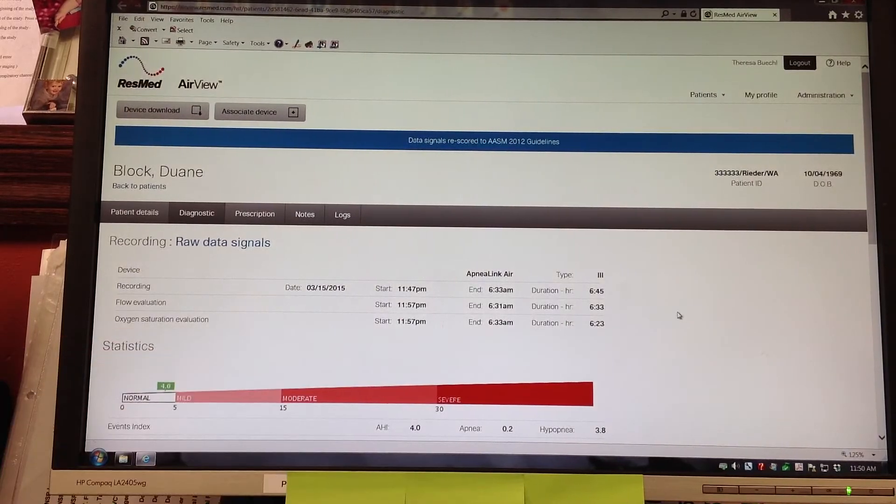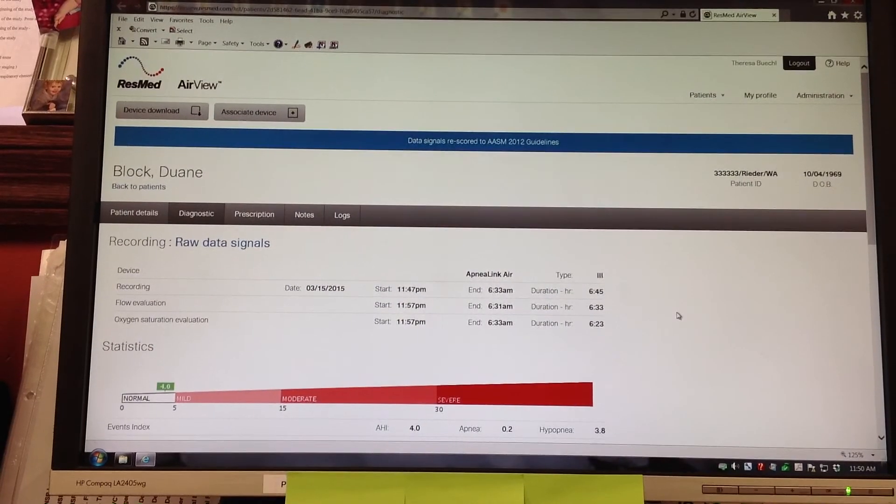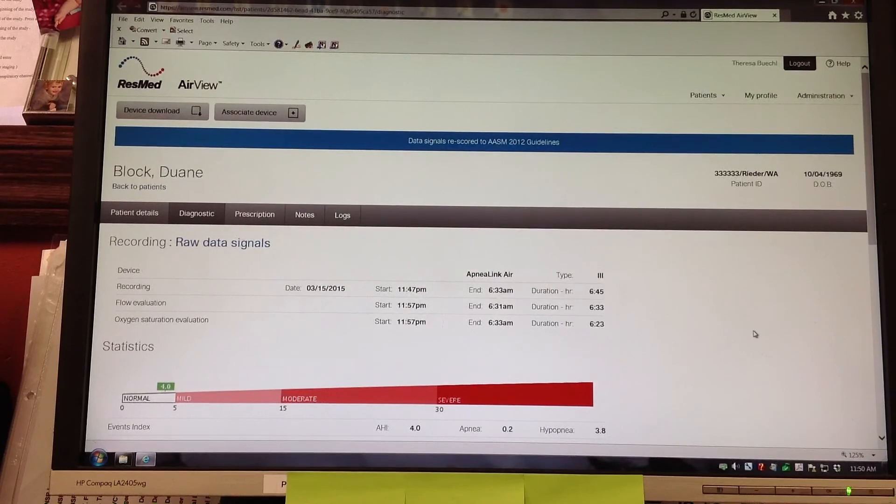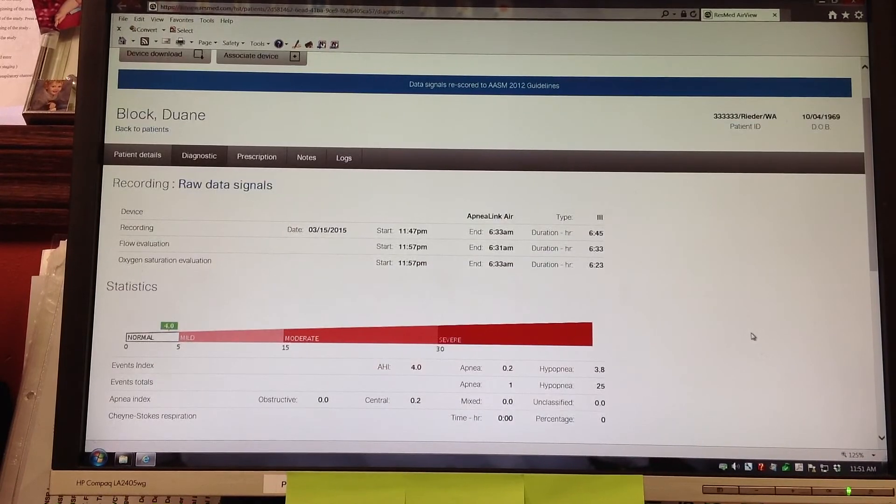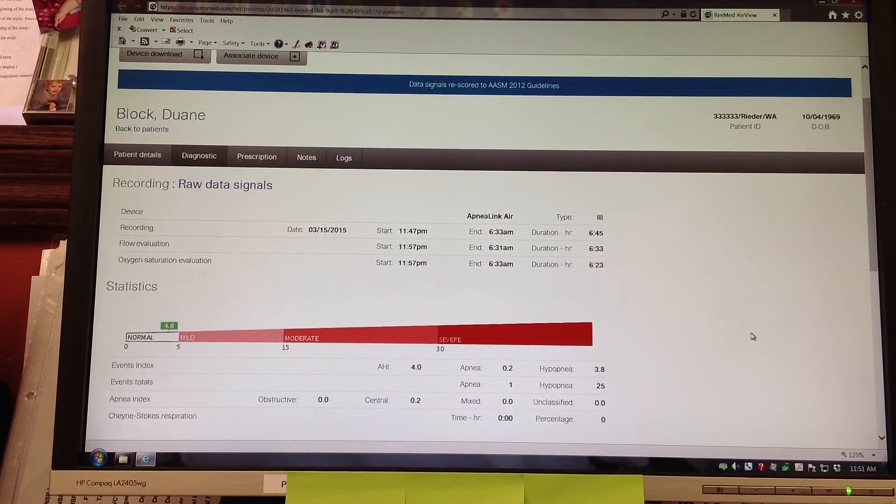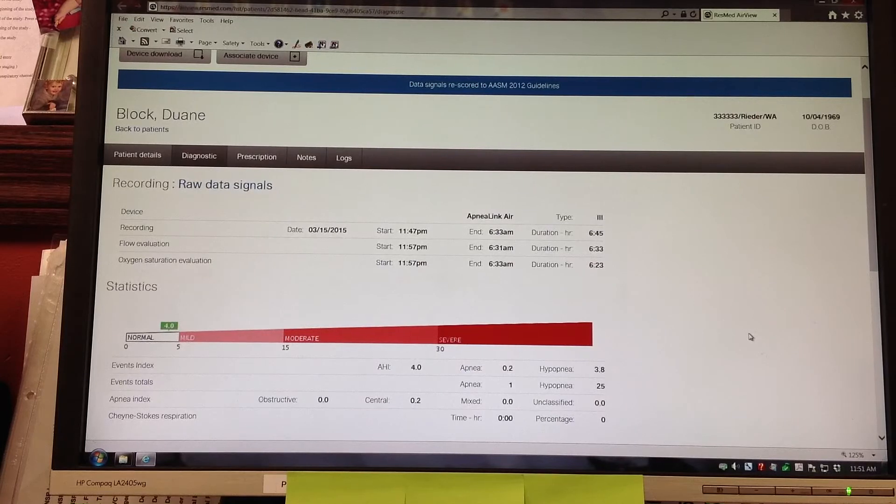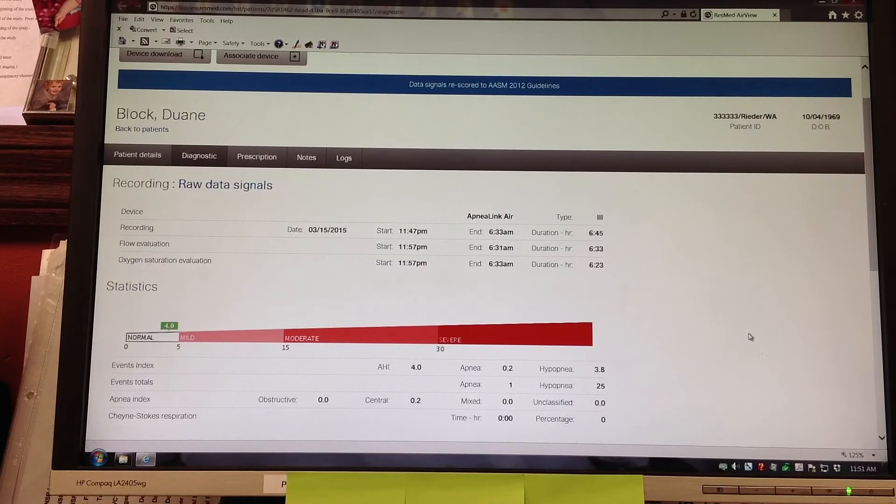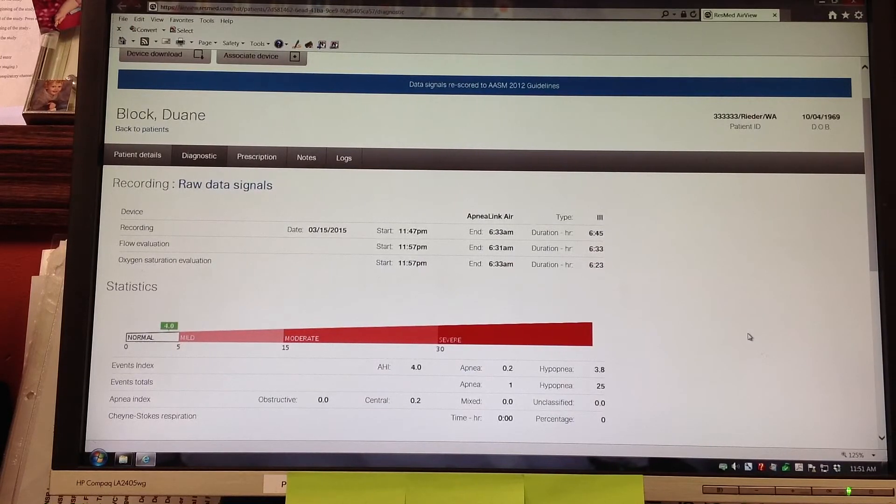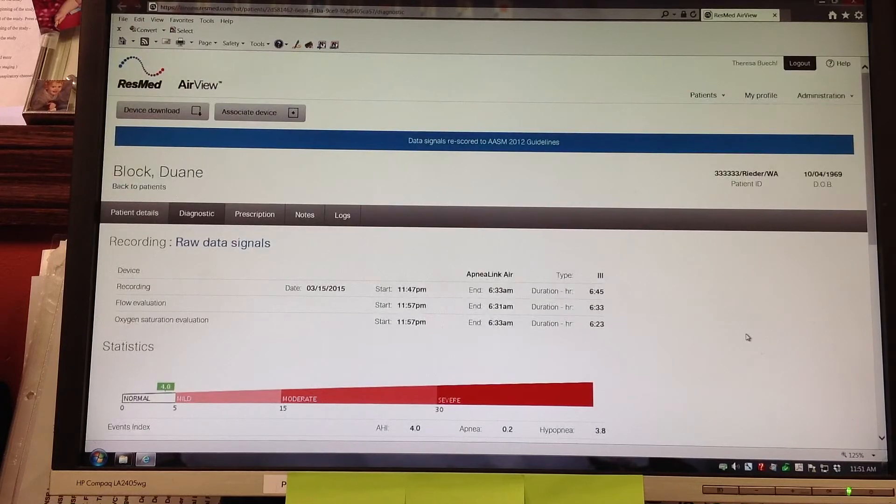The device can be cleaned. The battery is taken out and get ready for another patient. This now will go into the system for the registered sleep technologist to score and get to the interpreting sleep physician, which is Dr. Reeder in this case.